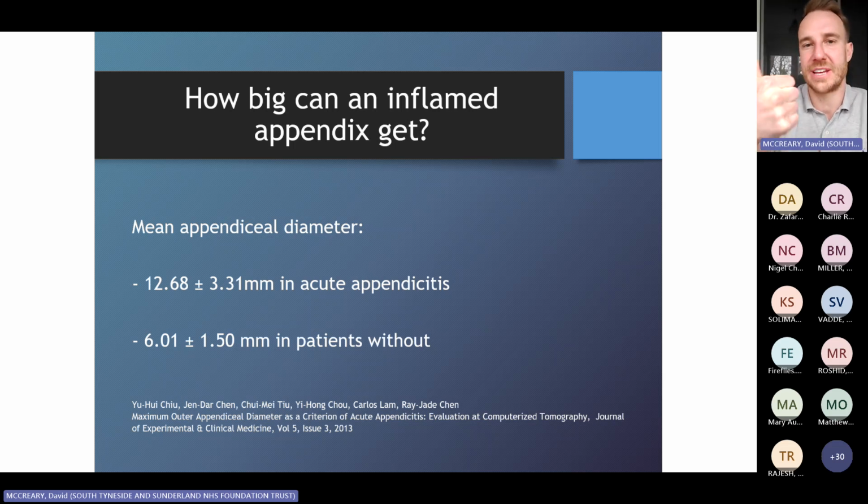So I would say you're looking for tenderness, and for your pre-test thoughts about probability in this particular child, and then you're scanning. If it's big and they're tender with secondary signs, it's appendicitis. If they're not very tender and it's borderline 0.6-ish, I would say don't get too excited. However, it could be an early appendicitis, couldn't it? So it might be that you scan them 6 to 12 hours later and things are a lot different. Does that make sense with everybody?